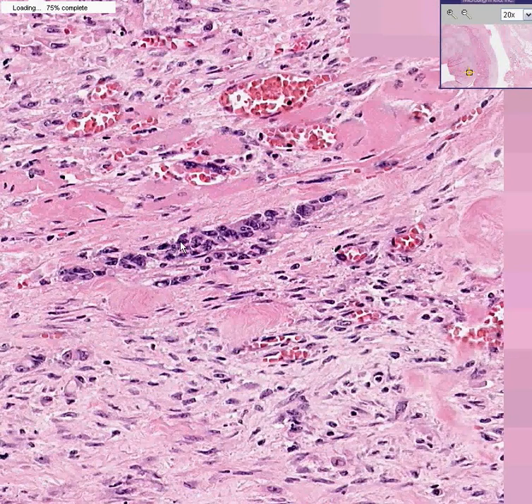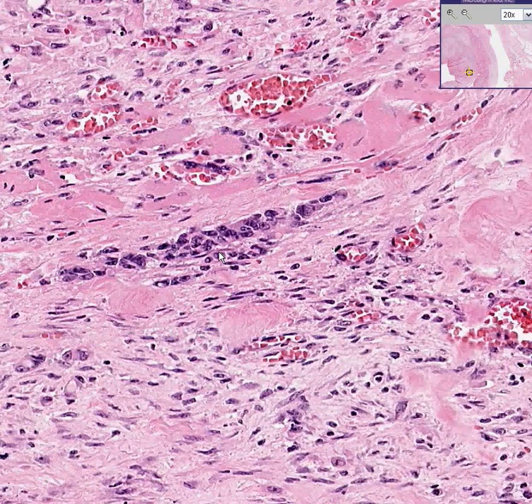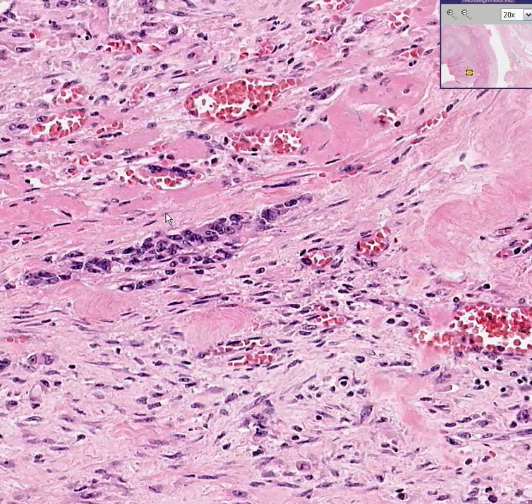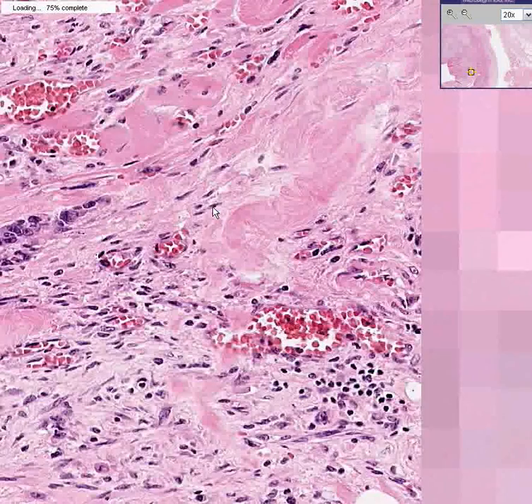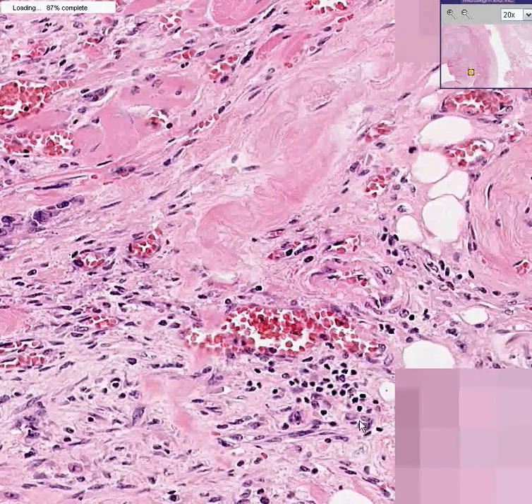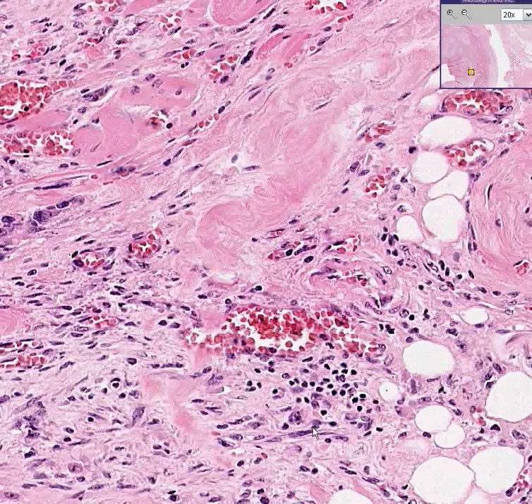We're about halfway through the stomach. We can see some tumor here — that's almost an abortive gland. There are tumor cells here as well. And here we just passed by perhaps a large blood vessel.